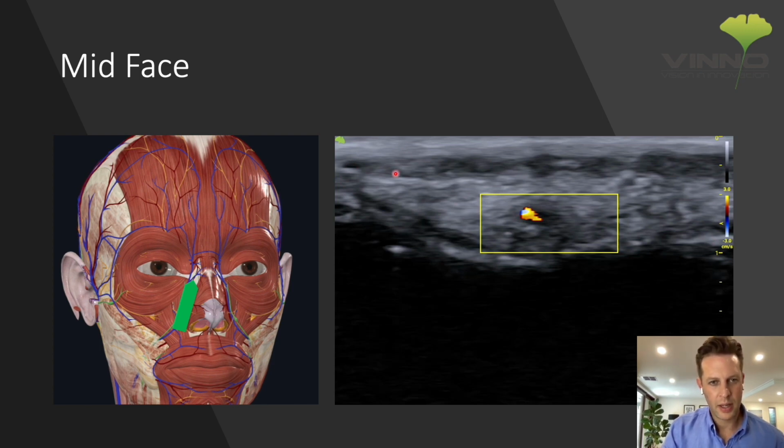I'll point out a couple of things before I start the video. This darker layer on the top running along this direction is our nasolabial fat. Then we're going to see the LLSAN muscle here and down here. And this is going to be our deep medial cheek fat around this area, just above the bone. So let's play the video.